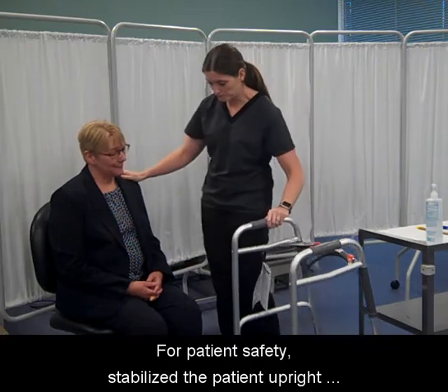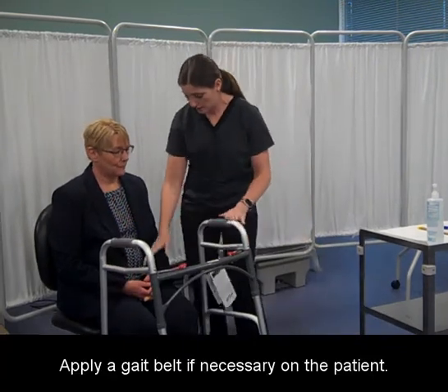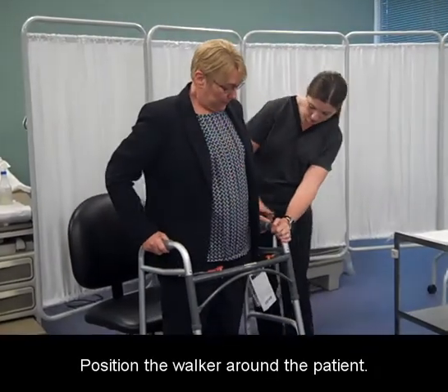For patient safety, stabilize the patient upright near a wall or chair for support. Apply a gait belt, if necessary, on the patient. Position the walker around the patient.